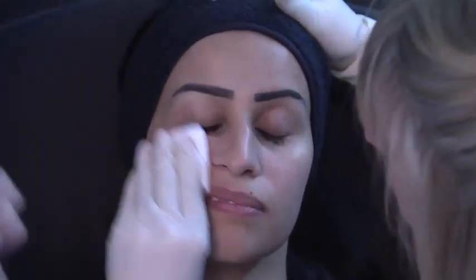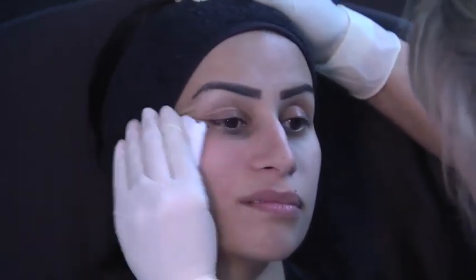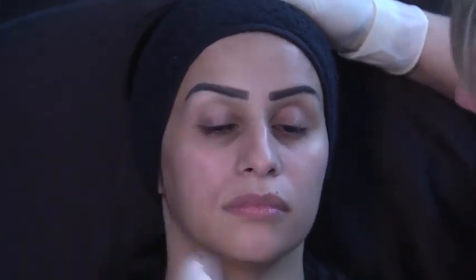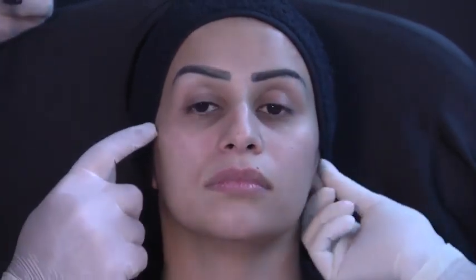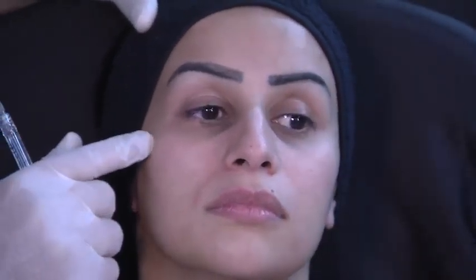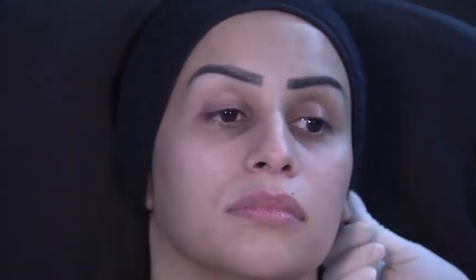In this case, when I want projection, and also answering the question that was made before, I'm going to use a needle and I'm going to use a bolus technique. Okay? So the first point is going to be in the junction between the zygoma and the zygomatic arch. We can palpate an indentation. Normally it's quite easy to palpate. So we have to go a little bit lateral to that point or a little bit medial, because that's the exit of the zygomaticofacialis nerve and artery, okay?